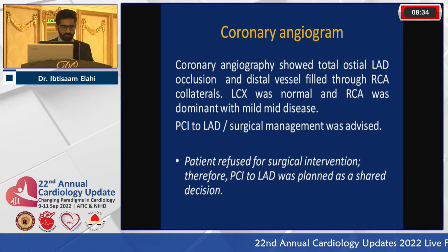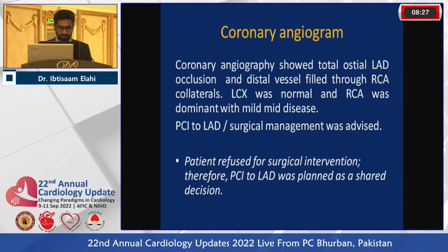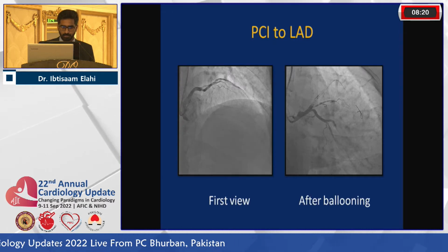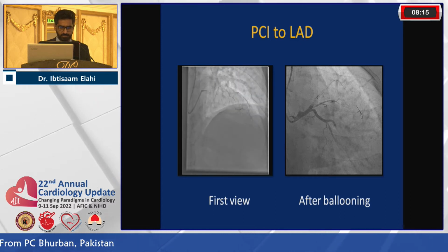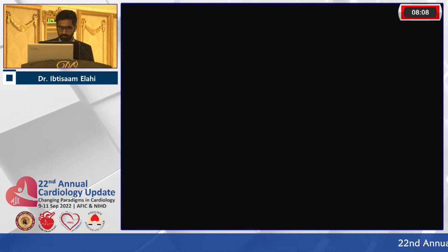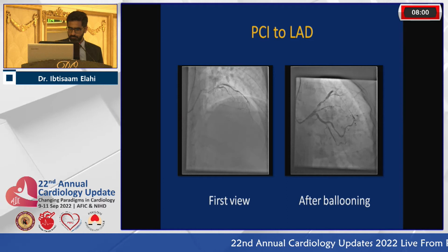PCI to LAD or surgical management was advised due to ongoing ischemia, but the patient refused surgical intervention. PCI to LAD was planned as a shared decision. This is the case in first view in which there is total ostial occlusion, and the BMW wire was passed to the LAD and it is ballooned with 2.5 by 15 mm.